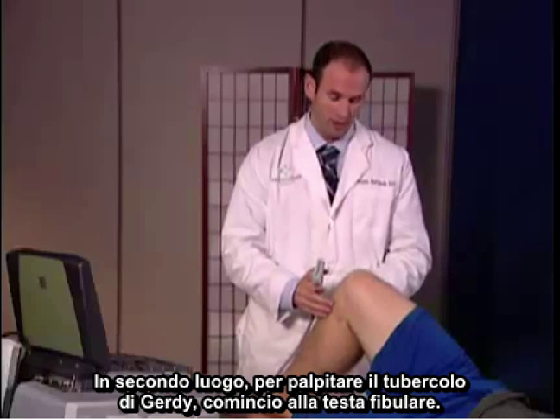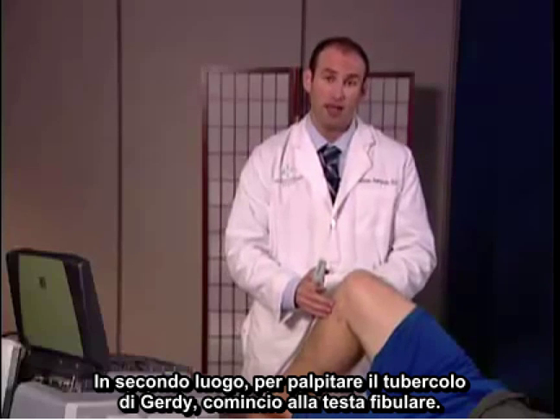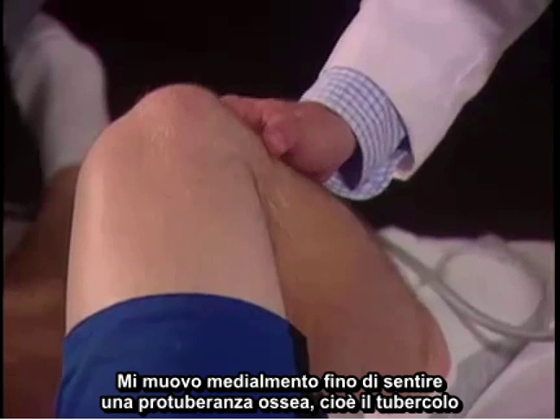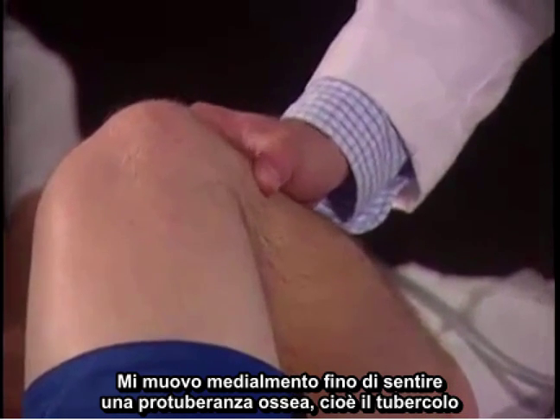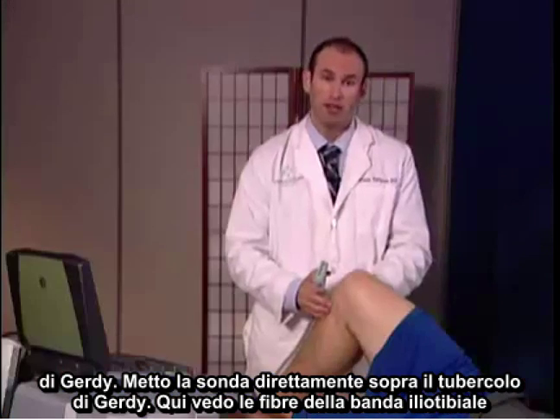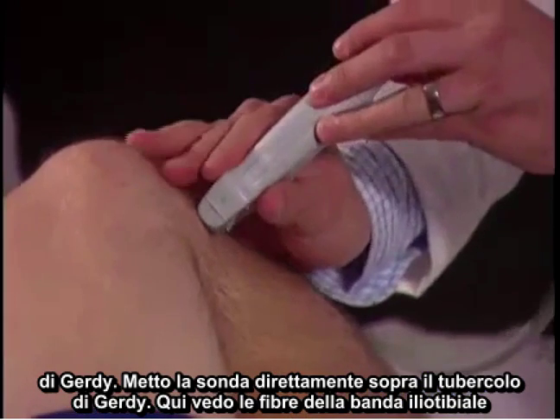To palpate Gerdy's tubercle, I begin at the fibular head. I move medially until I feel a bony protuberance, which is Gerdy's tubercle. I'm going to place the probe directly over Gerdy's tubercle.